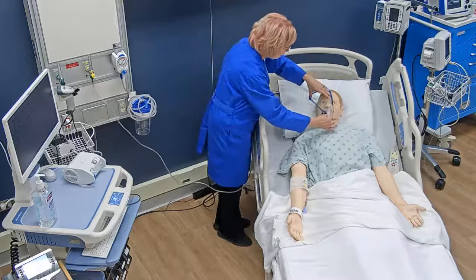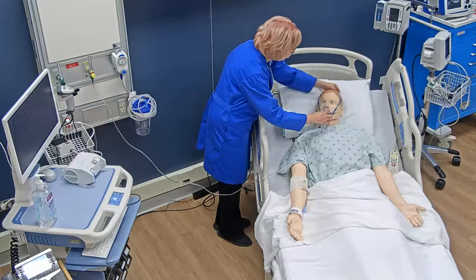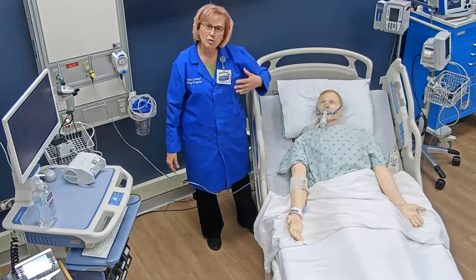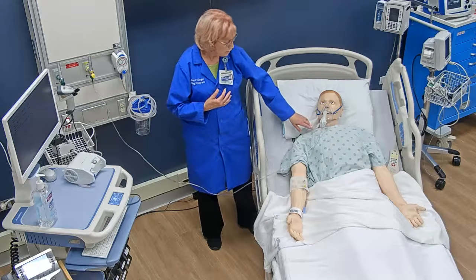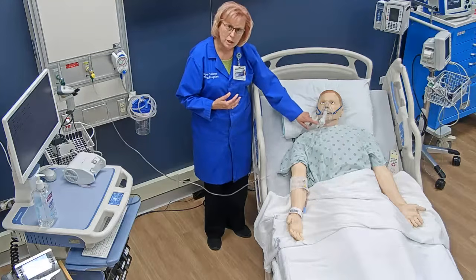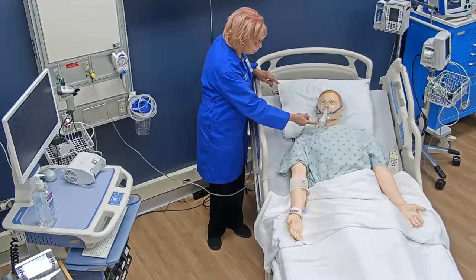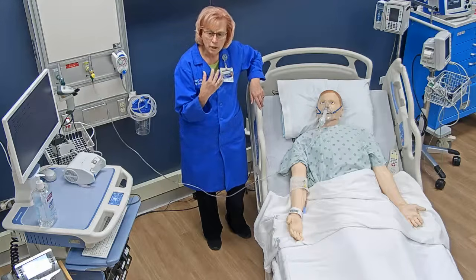I put the mask on my patient, making sure it's covering his nose and the mask is under his chin. And I instruct my patient while they are getting this medicine to take nice slow, deep breaths to try to get that medicine down into the lungs. As the medicine is being delivered, sometimes you'll notice a lot of drops collect right here. What you can do is give that a little tap and make sure the liquid is on the bottom, so it'll all be aerosolized and the patient will receive their required dose of the medication.